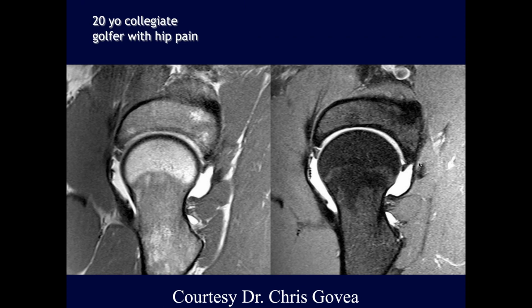Excellent. Specifically, highway is notorious for these injuries due to motorcycle riders. Yeah, motorcycle riders, back in the days before seatbelts. Jennifer, what do you think of this case?